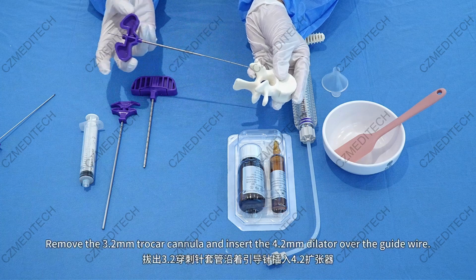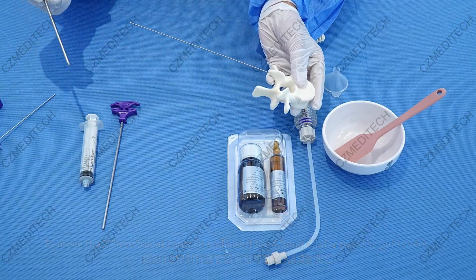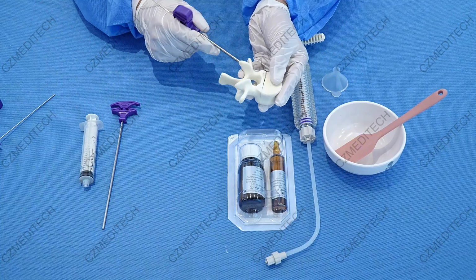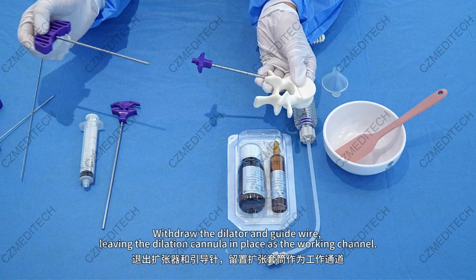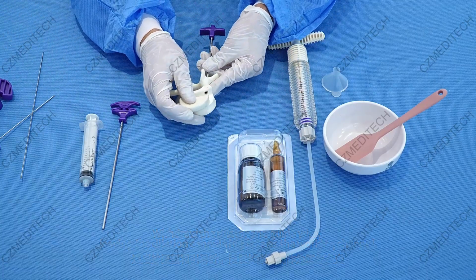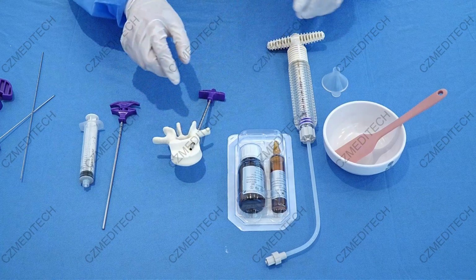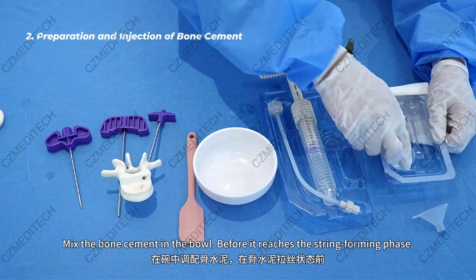Remove the 3.2 mm trocar cannula and insert the 4.2 mm dilator over the guide wire. Withdraw the dilator and guide wire, leaving the dilation cannula in place as the working channel. Mix the bone cement in the bowl before it reaches the string forming phase.